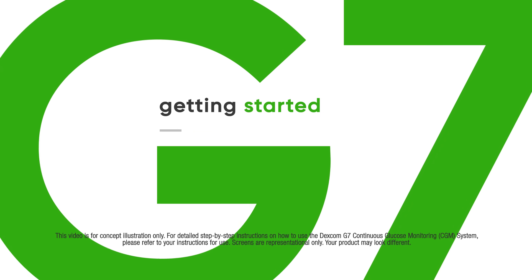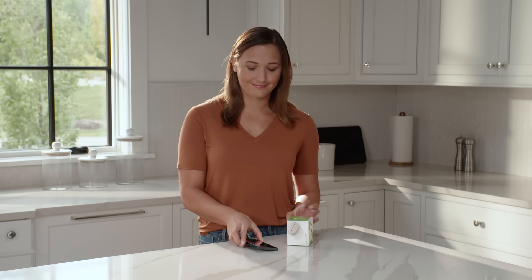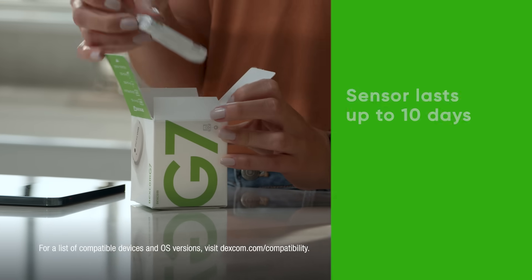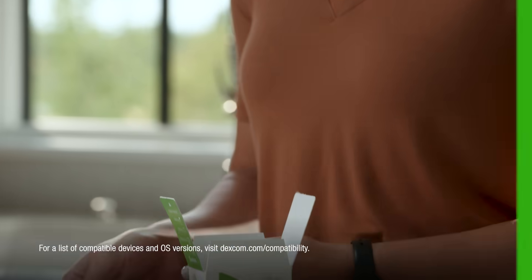Getting started with the Dexcom G7 app is easy. Abby has just received her system. Let's watch her set it up. The Dexcom G7 box contains your applicator with built-in sensor, overpatch, and your instructions for use.